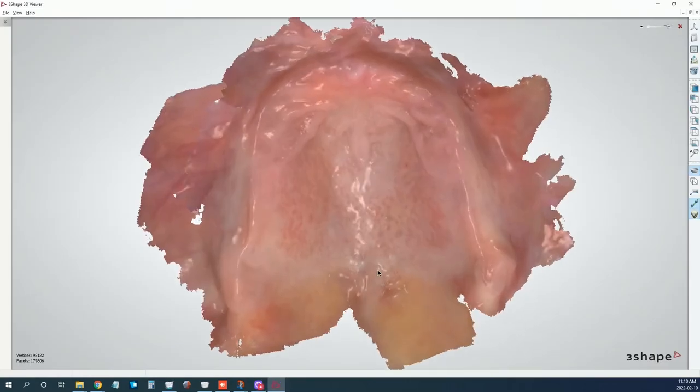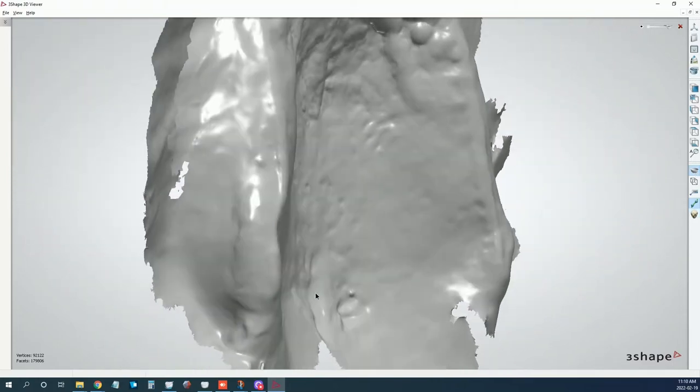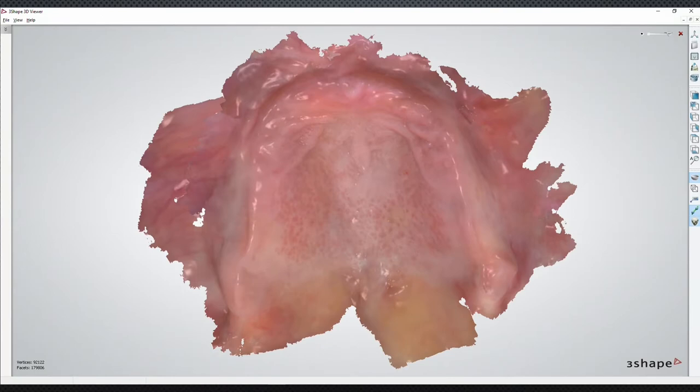So, of course, I go in there, and I'm looking at this. It's got really short borders, and I'm like, well, you know, we're probably not going to get that much retention. And the wisdom is, with digital, you don't really need to carve a post dam in these things because the only reason you were doing that was because you were trying to account for polymerization shrinkage. So in here, you can look at this scan, and usually what you do is you kind of look for the palatine fovea and you know, carve this butterfly post dam in there arbitrarily. And you don't really know where you're at. Or if you're lucky, you had a doctor who would actually border mold and mark it with a permanent marker. But with this, I'm able to see that clear demarcation between hard and soft palate.